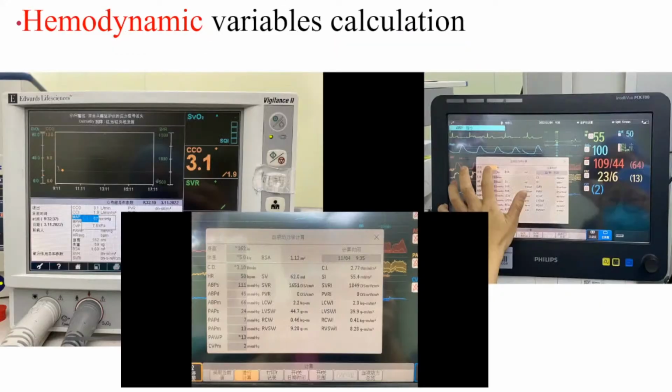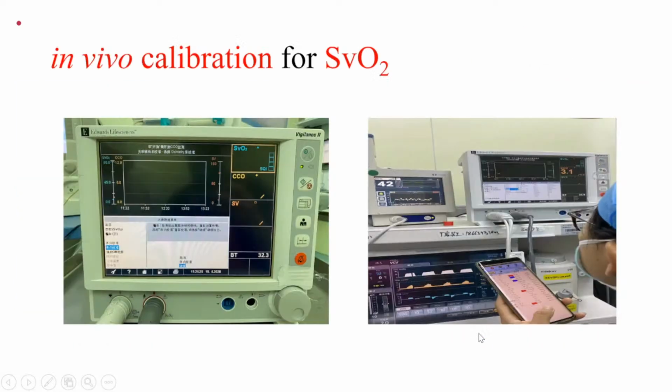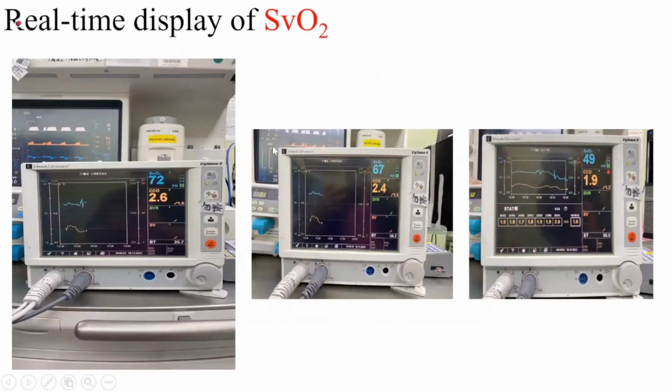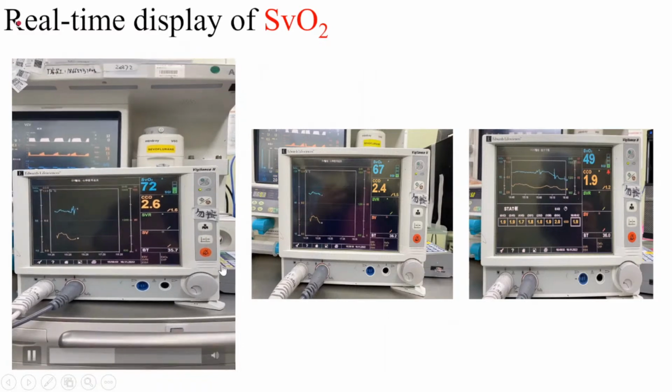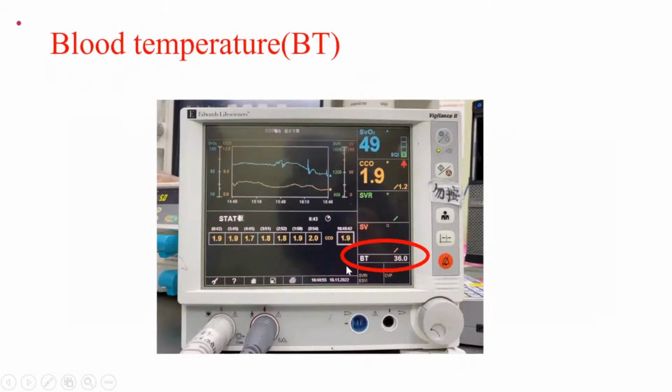After the PAC is in place, hemodynamic variables can be calculated. Pulmonary artery blood is sampled and blood gas analysis is performed. SvO2 is calibrated in vivo. After completion, SvO2 can be displayed on the screen in real time, as you can see from the left side. As shown here, PAC provides constant measurement of blood temperature, which is an accurate reflection of core body temperature.